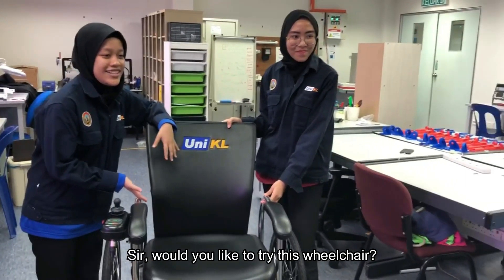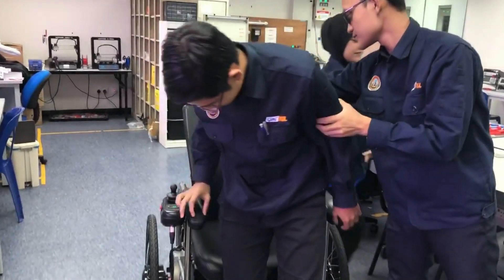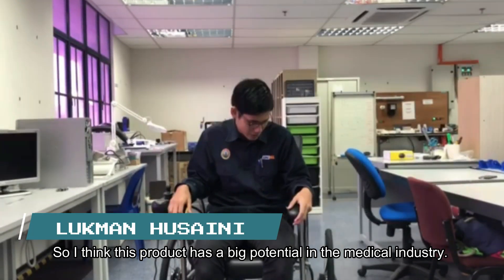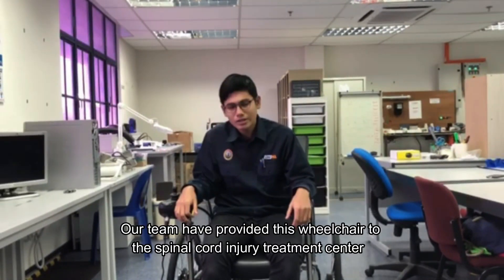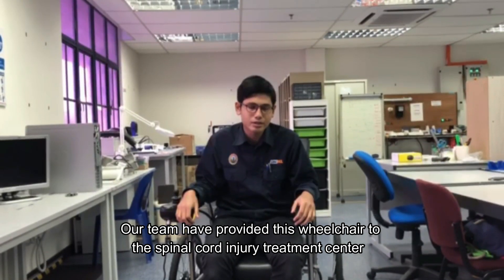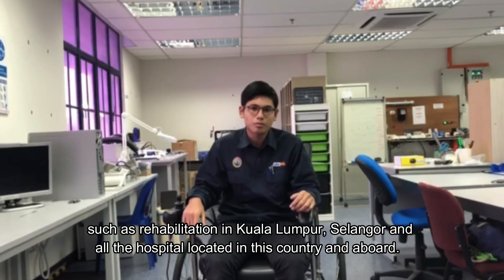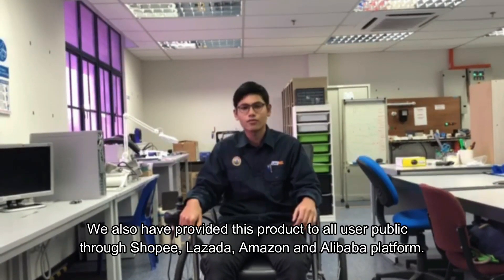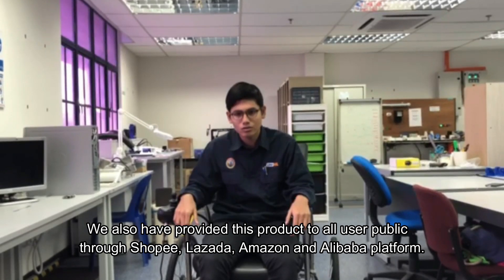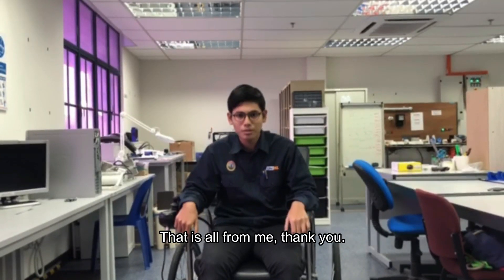Would you like to try this wheelchair? Oh, sure. Oh, I feel comfortable. I think this product has big potential in the medical industry. Our team has provided this wheelchair to spinal cord injury treatment centers such as rehabilitation centers in Kuala Lumpur, Selangor, and hospitals across the country and abroad. We have also made this product available to the public through Shopee, Lazada, Amazon, and Alibaba. That's all from me. Thank you.